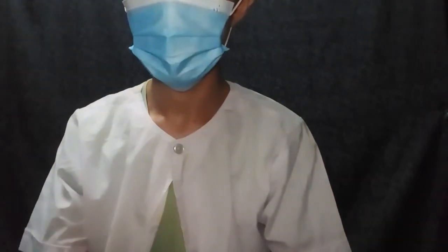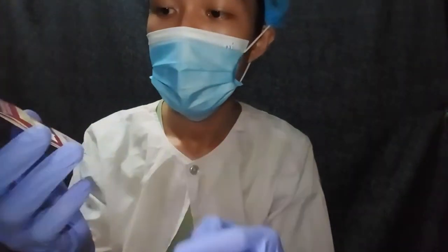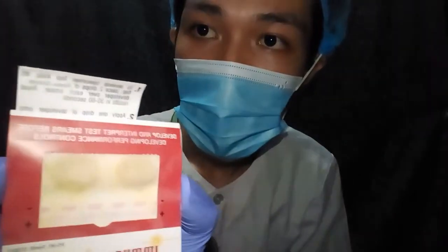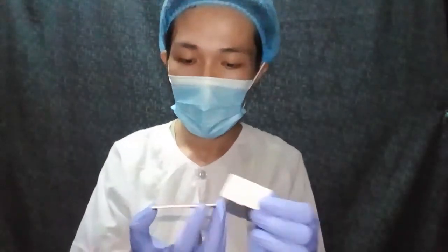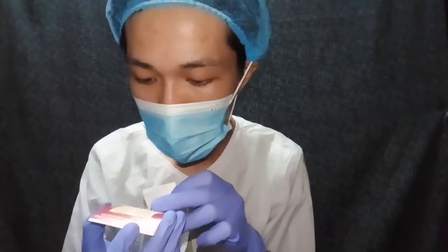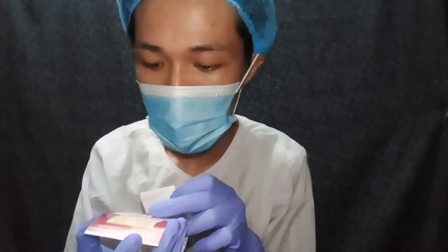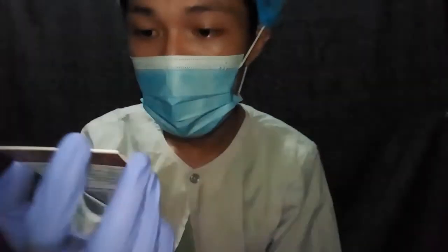I'm just waiting for the result. As you can see, there is no color change observed, and here on my end I can see that the positive side has become blue — a little bluish. I don't know if it is visible on your screen, but on my end I can see a pinch of blue color.